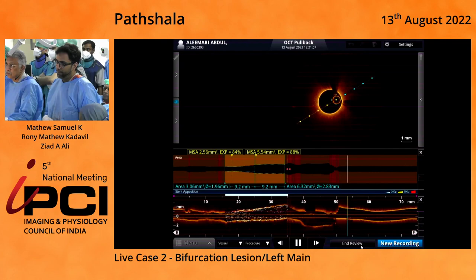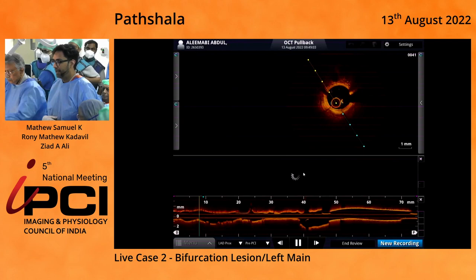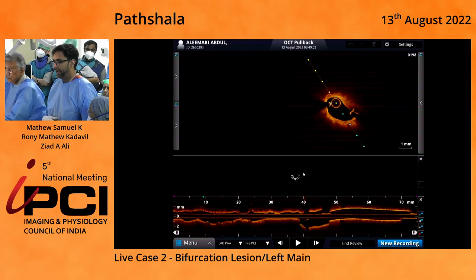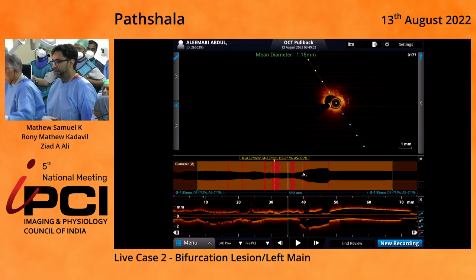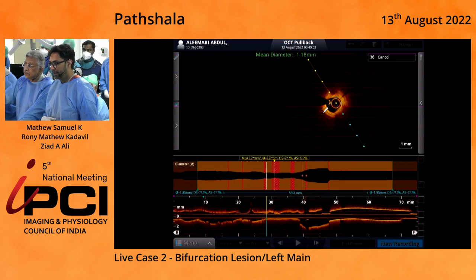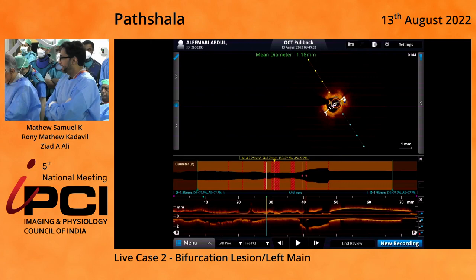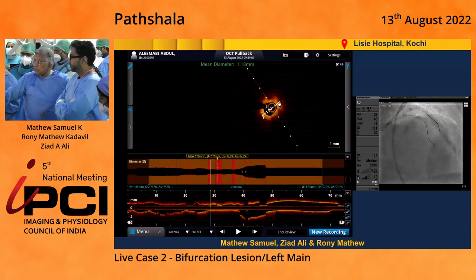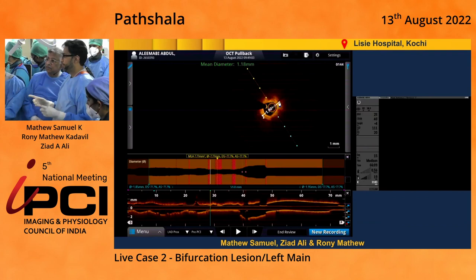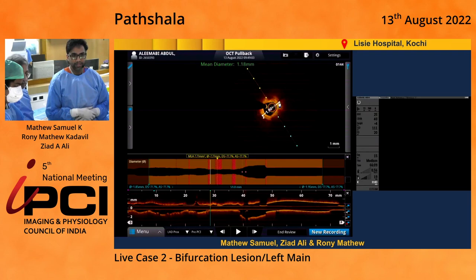What did we learn from this case? Probably one of the reasons this happened is because if you look at the very proximal LAD, this is a very negatively remodeled vessel. The first time we can see some resemblance of vessel is after this branch - this artery is actually negatively remodeled. We're getting around 1.9. The key here was to persevere in order to get the Graftmaster in. Use a longer 6 French multipurpose guide, put in a shorter 8 French EBU 3.5, anchored with a balloon and pushed hard to break the struts, then deployed the Graftmaster.